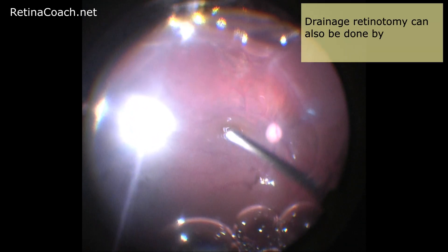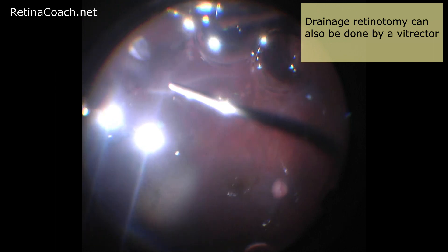Thus, after retinal flattening, this area can be easily observed. Drainage retinotomy can also be done by a vitrector. However, in this case, retinotomy will be larger and after retinal flattening it will be challenging to observe the border of the retinotomy for optimal subretinal fluid drainage.